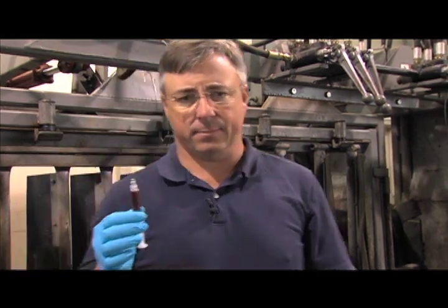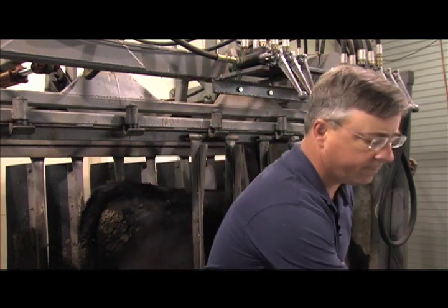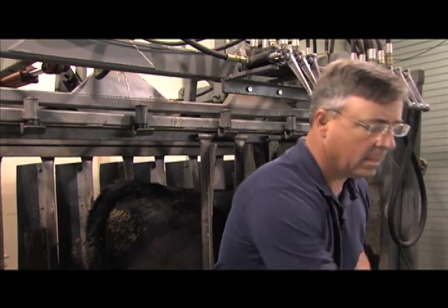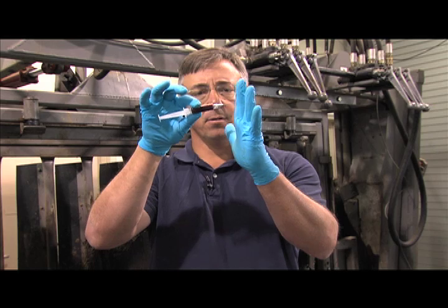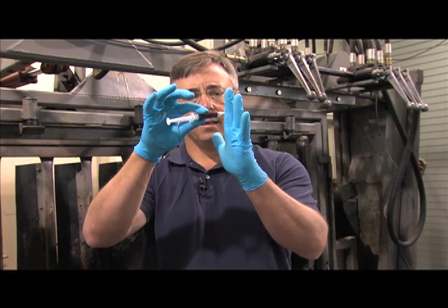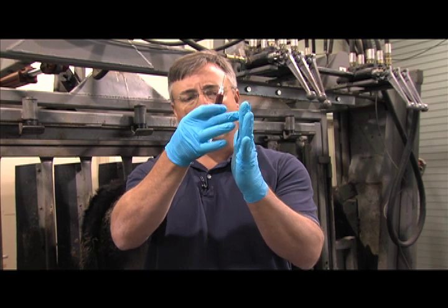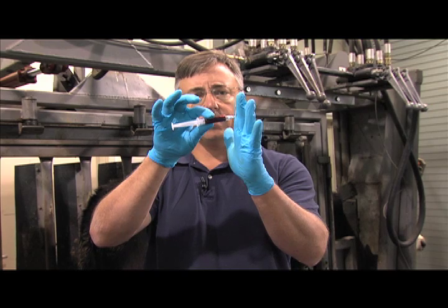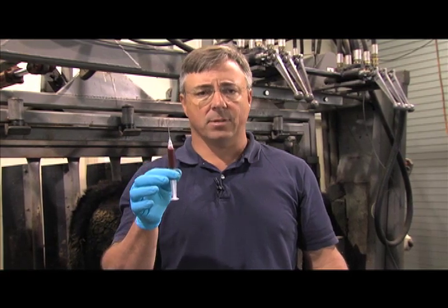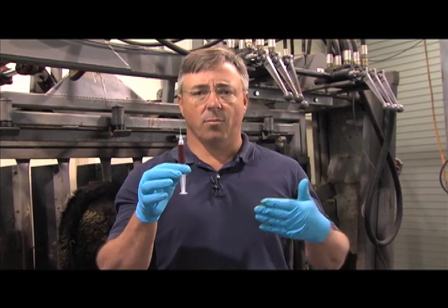A couple of the keys to quick and accurate blood sampling. Number one, on that tail head, there's the groove. The needle must be perpendicular, not angled up, not angled down, not angled side to side, so that you can quickly penetrate the blood vessel, the vein that runs in that groove, and that you can draw the sample. Also, please use a new needle and new syringe for every sample. This prevents disease spreading. This also prevents contamination from one sample to the next.